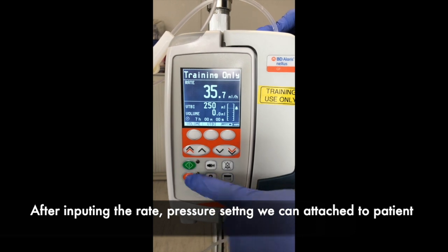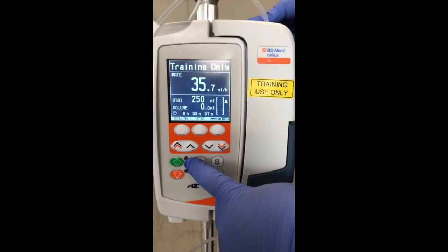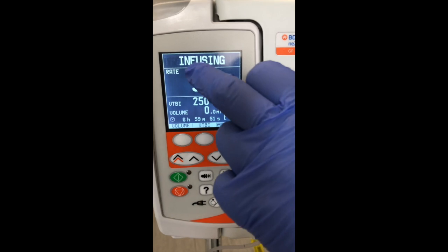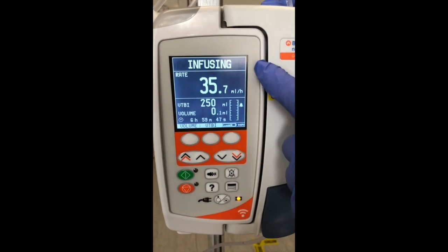Press green run button. It comes up with the flashing light next to the green button, and it says infusing. With your profile, it will alternate between your profile and infusing. With us, we are using training only.